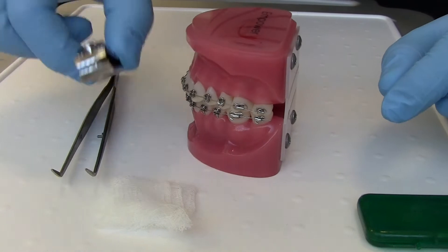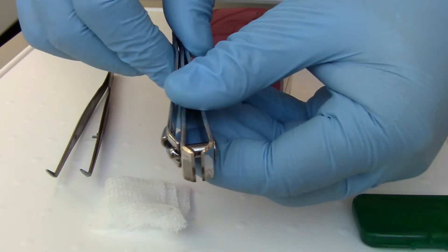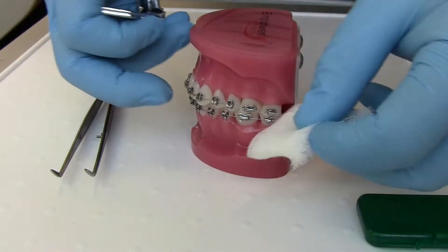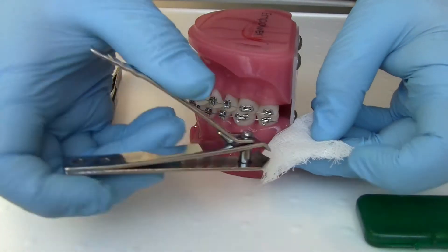Alternatively, what you can do at home is grab some clean nail clippers and trim off the long bit of wire. Please place the cotton pad or gauze towards the back of your mouth so it can catch any bits of wire trimmed off.